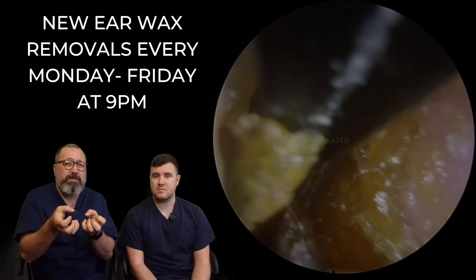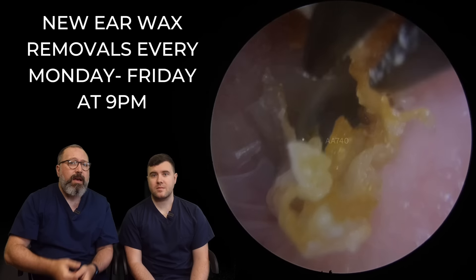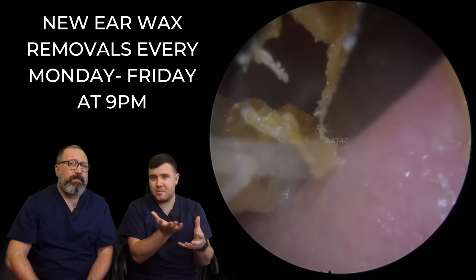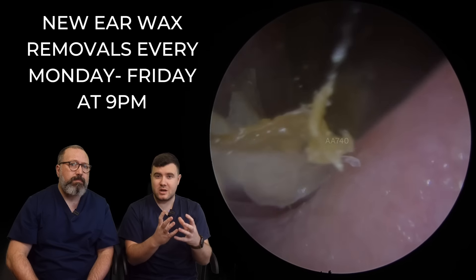So we use suction first just to loosen everything, and then we can pull these individual layers out with the forceps. This is the fine jaw forceps you can see in here. We're getting some good movement from this skin — it's not breaking apart, which is always handy. Good chunky bits. And the back end there, that's the fresher skin, that looser, wetter skin, and that's just what's kind of pushing and building up on that drier section at the front.